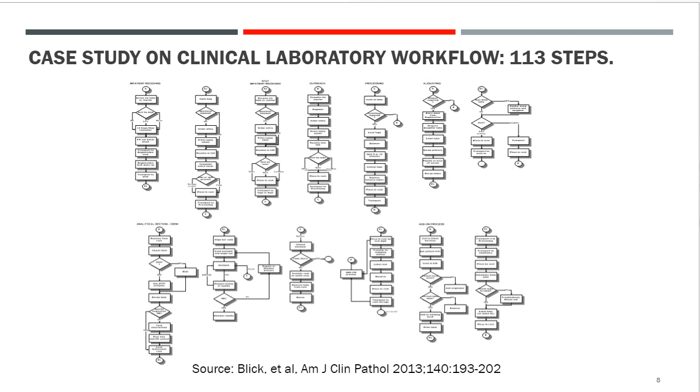Out of the 113 steps, one, this little red box right there, says analyze. I know it's too small to read. It says analyze. The other 112 steps are leading everything up to the analysis and everything after the analysis. So it's pre-analytical and post-analytical. There's only one box that actually says analyze.